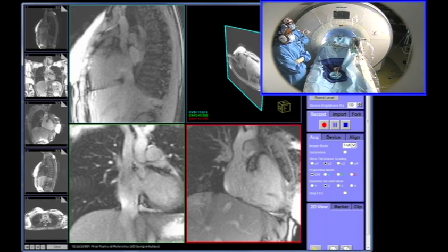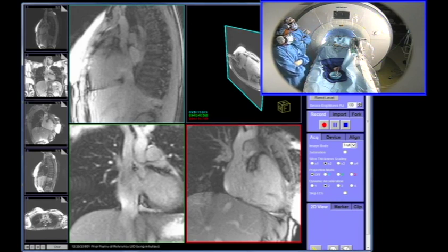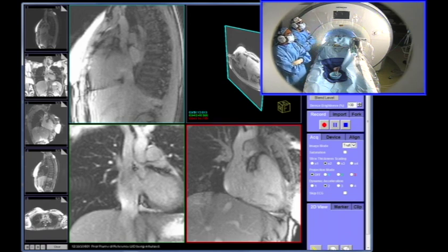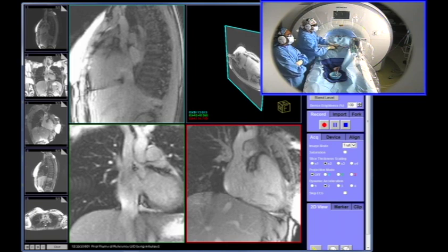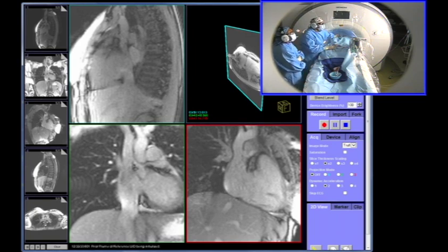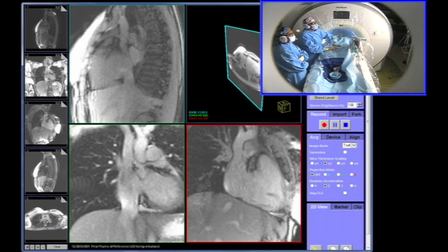We've acquired these images in advance so that as we navigate through the heart, we have all the images we think we'll need to be able to perform the procedure. But these can be adjusted interactively — if we have time, we can show you some of that later. Okay Lou, let's go coronal RV view.